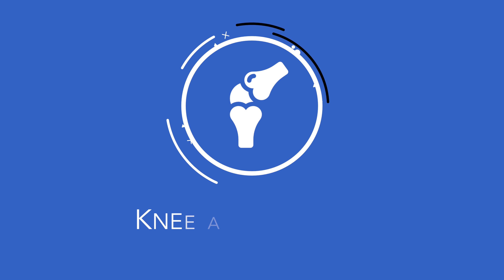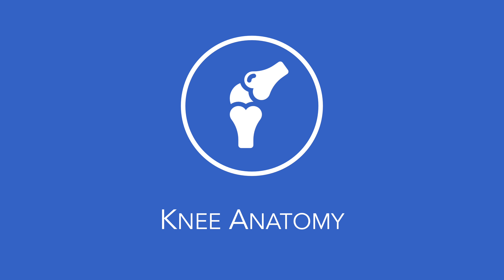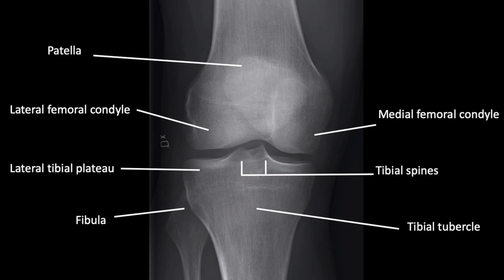When looking at anatomy on x-ray, it is important to remember that there is so much tissue overlap - it's just like looking at a whole book printed on one page. This is an AP radiograph of the knee showing the patella, lateral and medial femoral condyles, the tibial spines, lateral tibial plateau, medial tibial plateau, tibial tubercle, and the fibula.